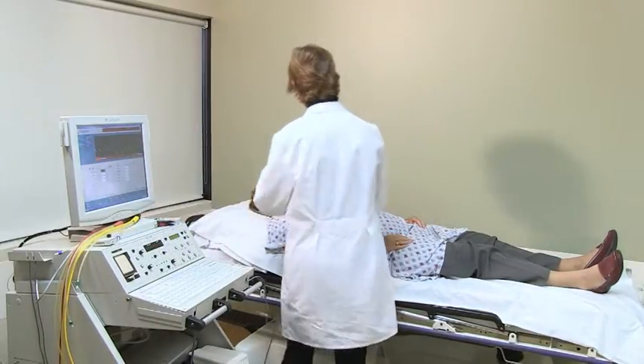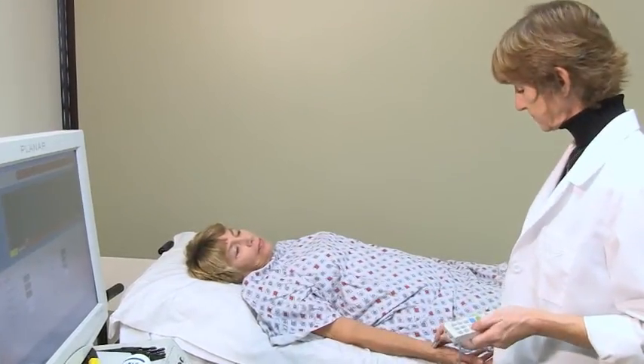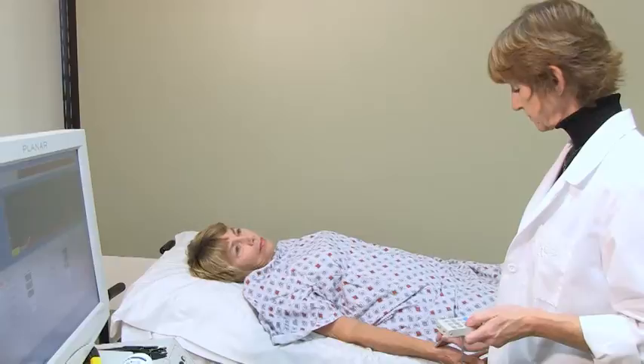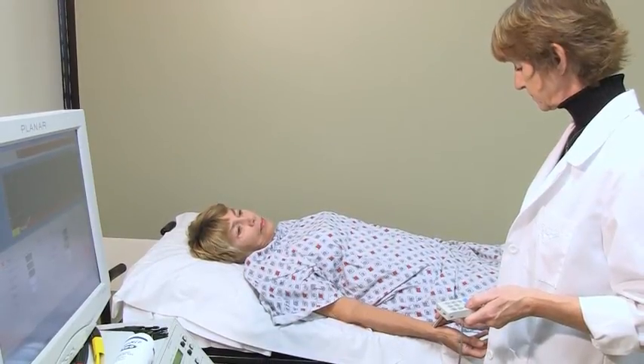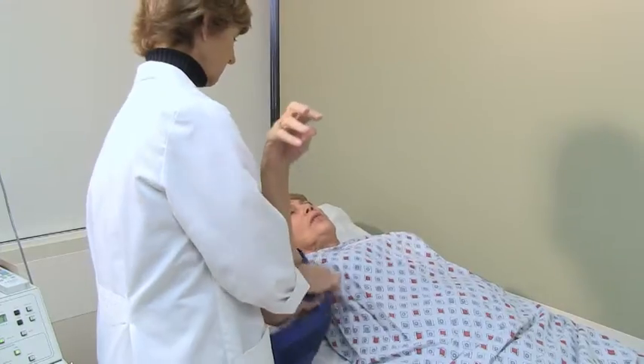The technologist will listen to the pulses in your shoulder, arm, and wrist using an ultrasound probe. You will hear a swishing noise as we measure the pulses. They will then place blood pressure cuffs on your arms.